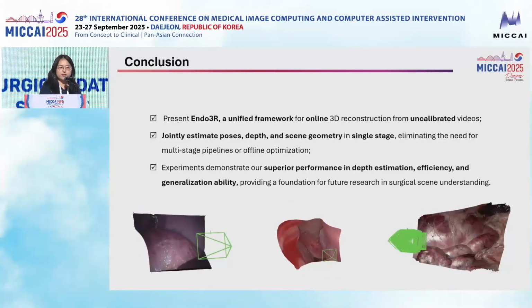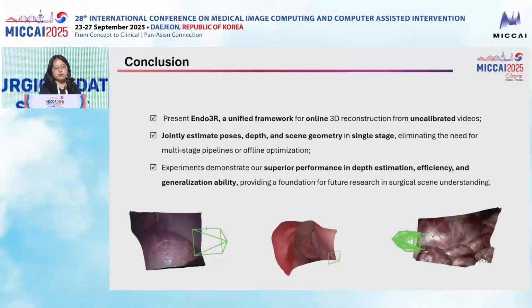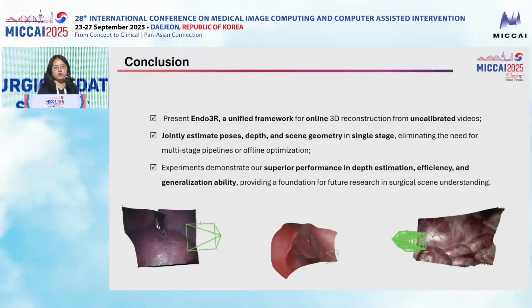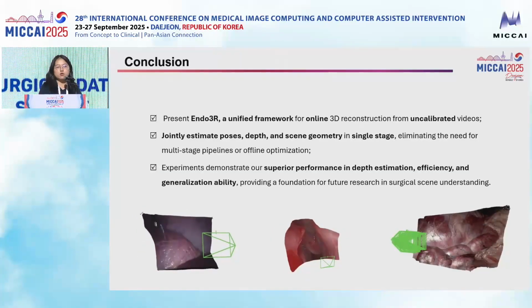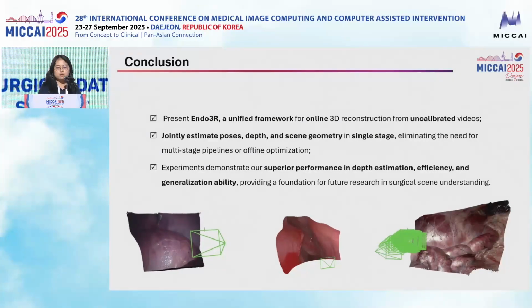But we also find there are some limitations in our method. For example, if the given sequences are too long, our method will have some drifting artifacts. So it's also our future work to enhance our robustness and accuracy under such scenes.